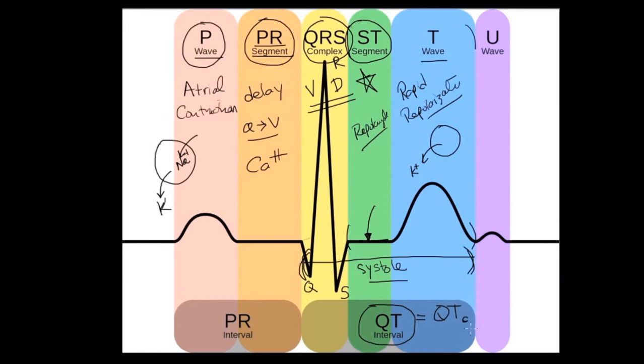That means it's corrected. We'll talk about how we get to that equation. But you should very routinely be tracking patients who have prolonged QTCs, because certain medications like fluoroquinolones, amiodarone, and azoles can increase the length of the QTc and cause malignant arrhythmias.